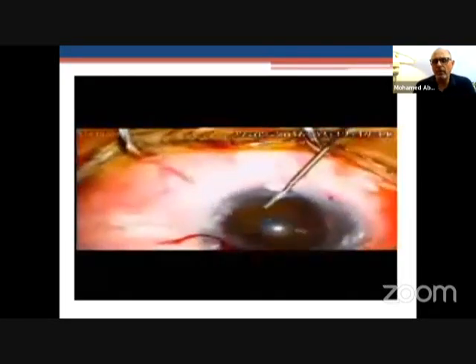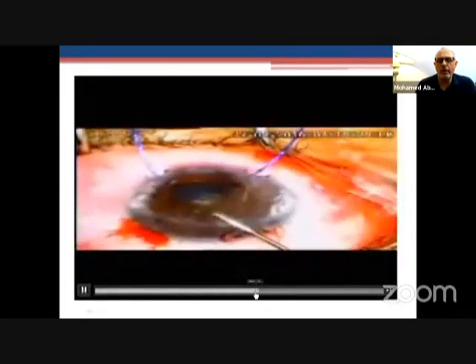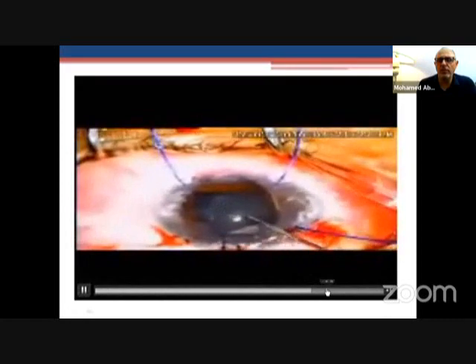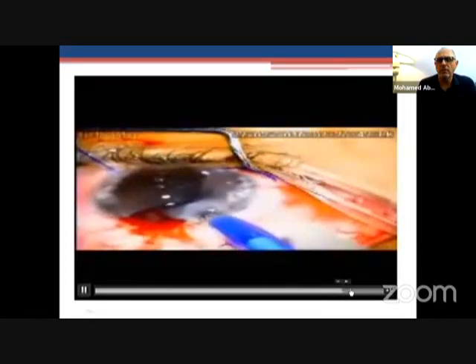by sweeping the viscoelastic cannula. Once I've done that, I entered properly and did a posterior synechiolysis again with the viscoelastic cannula. Put some iris hooks, did the usual phaco, put the IOL in the bag again. And then in children, sometimes you need to put a suture. Usually you have to put a suture because the cornea is too pliable.